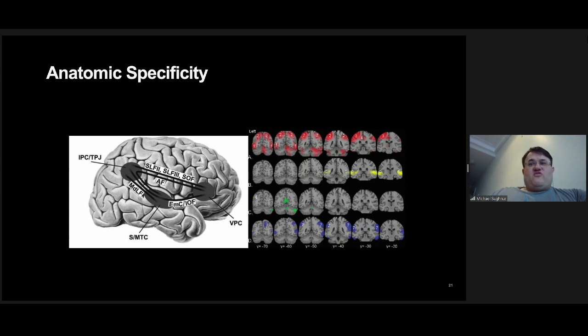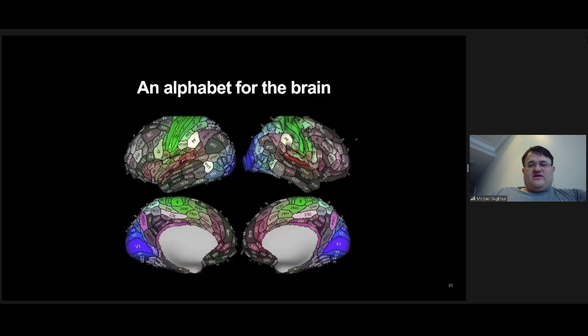So we've built this into the software through work that I've done for many years, leveraging what a lot of other people have done. This scheme is heavily grounded in the Human Connectome Project scheme published in Nature in 2016. It's not to say that this is the only possible atlas we could have, but it is a pretty good atlas if you've read the methodology. It utilizes a lot of things we're familiar with, so it's learnable. It has Brodmann areas in it. It has visual V1 cortex. Most people know what area 4 means, so you're not starting from scratch when you become familiar with some of the naming. Even though there are a lot of new areas, it's not completely foreign.